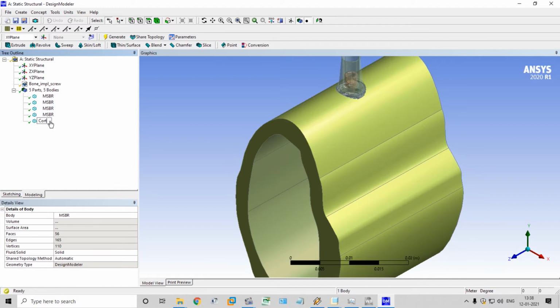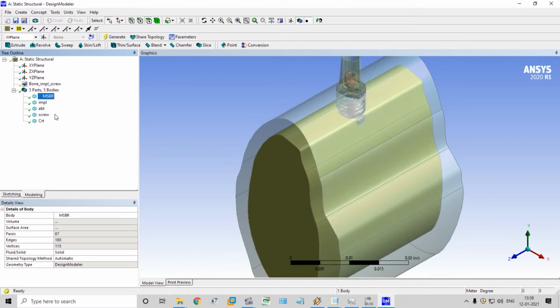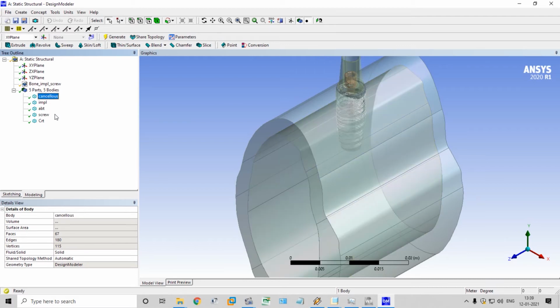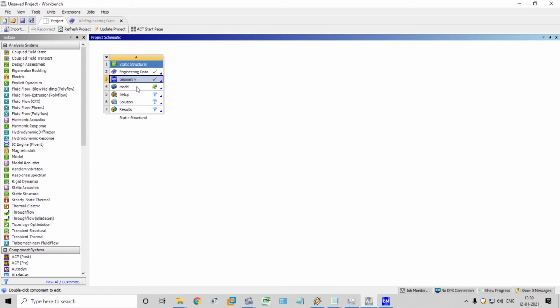First of all, just in short form, F2 is rename: screw, F2 ABT abutment, F2 implant, then cancellous. Okay, got renamed. Okay, next come to Workbench model.